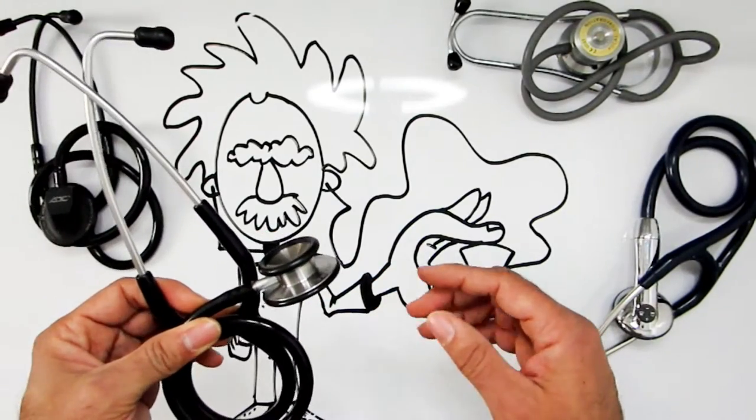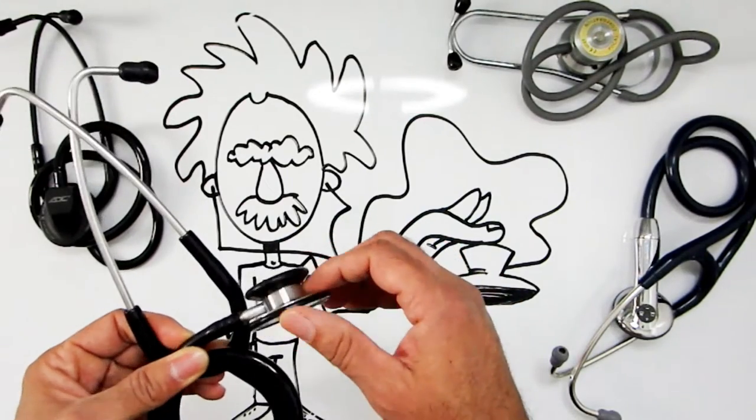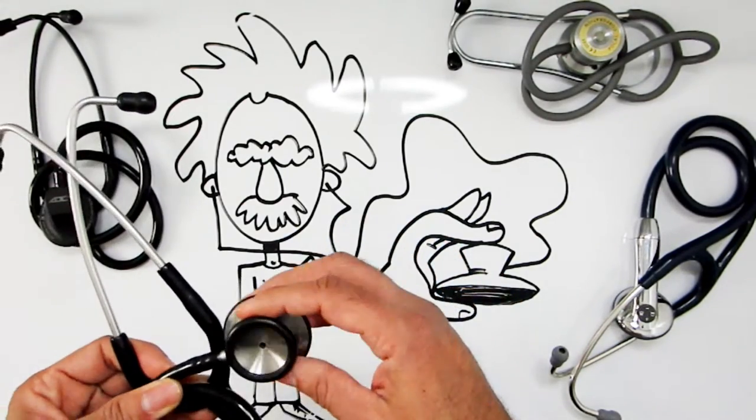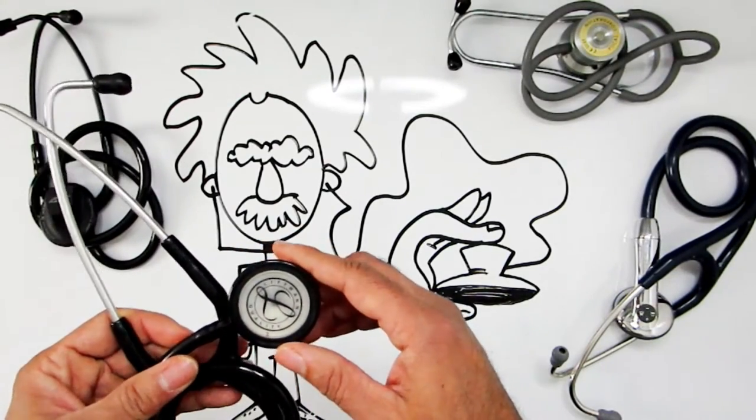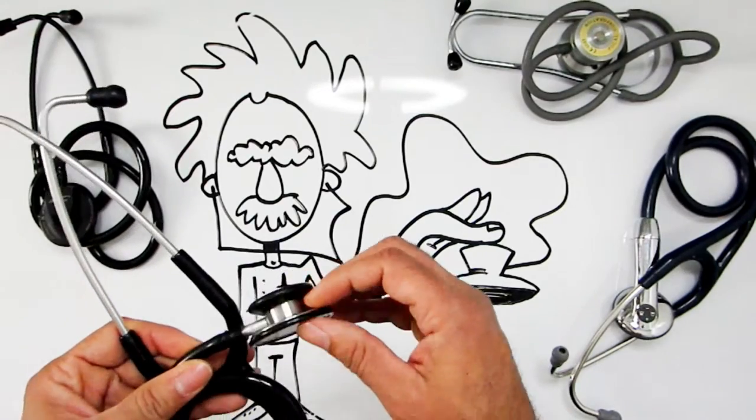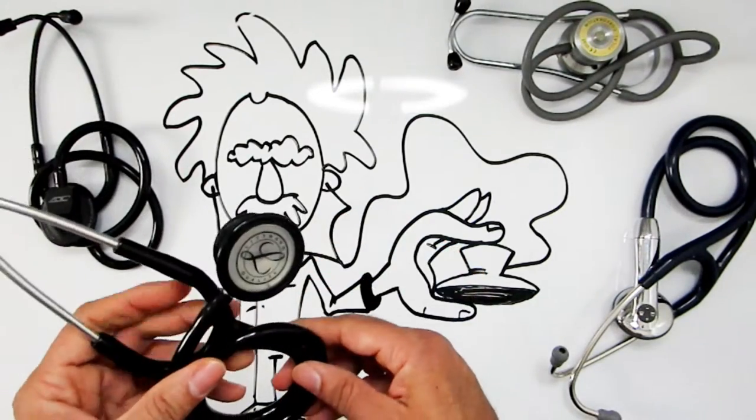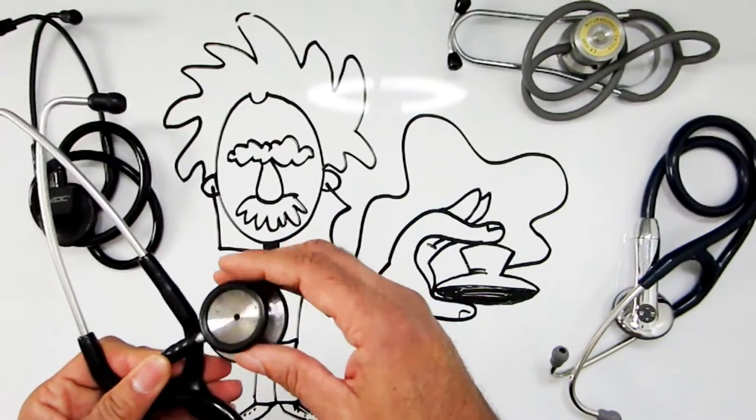My very first stethoscope was this one. It's a Littmann and it has the traditional bell and diaphragm. The bell and diaphragm are basically designed to capture two different ranges of acoustic sounds - one is for high frequency and one is for low frequency. I actually used this for probably around 15 years and it still works to this day.